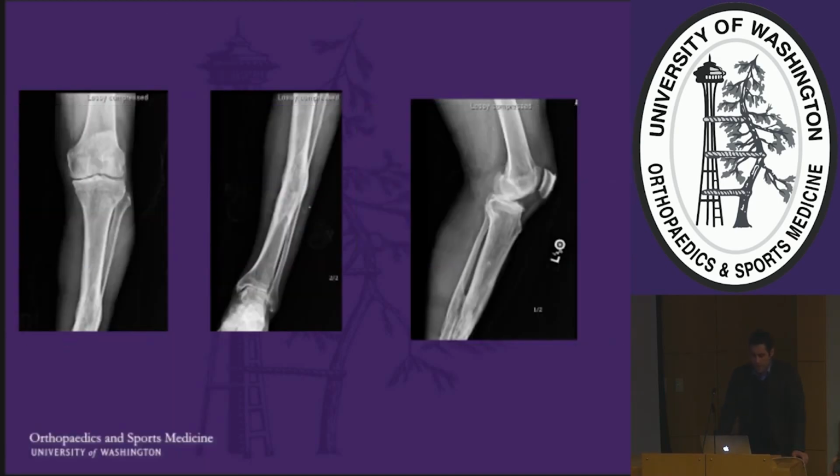Finally, another case where we used this was someone that had had a previous malunion of a tibial shaft fracture from a blast injury, and you can see here there was no real reliable intramedullary or extramedullary landmarks that we could use, and the accelerometer allowed us to put the center of the knee above the center of the ankle mortise and allow him to have better biomechanics.